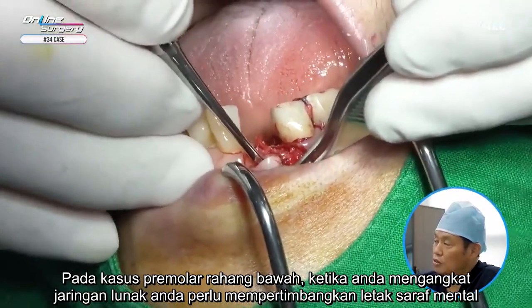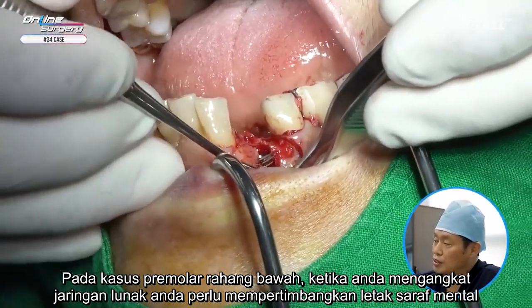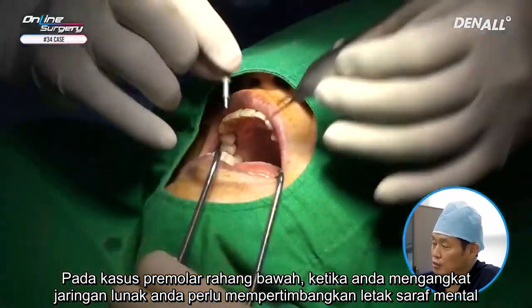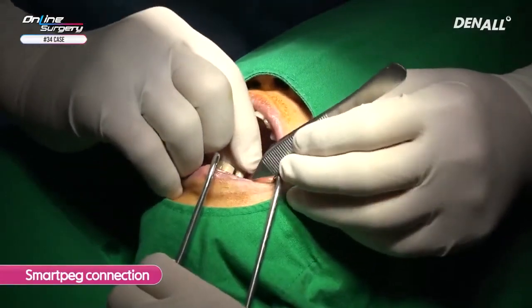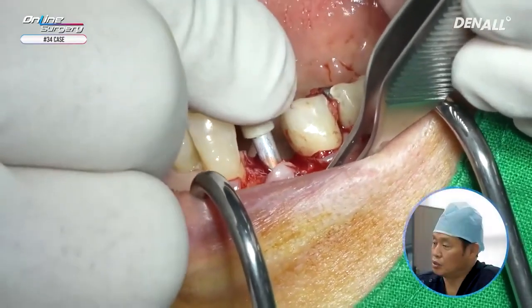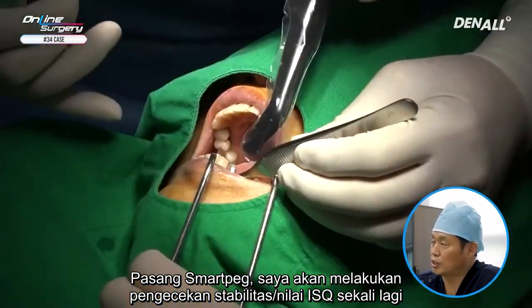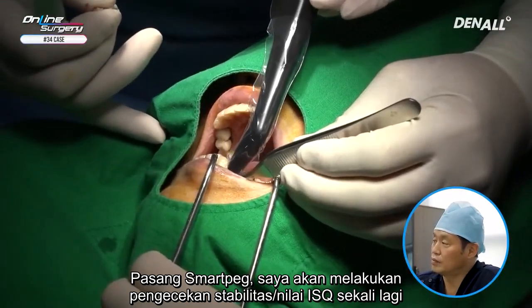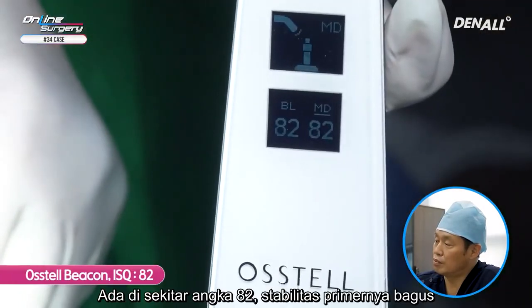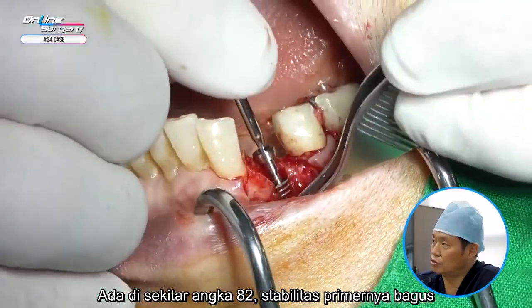In the case of a lower premolar, when you elevate the soft tissue, you need to consider the position of the mental nerve. Smart peg is connected. I'm going to check stability once again. I'm going to check the ISQ value. It's approximately 82. Primary stability is good.